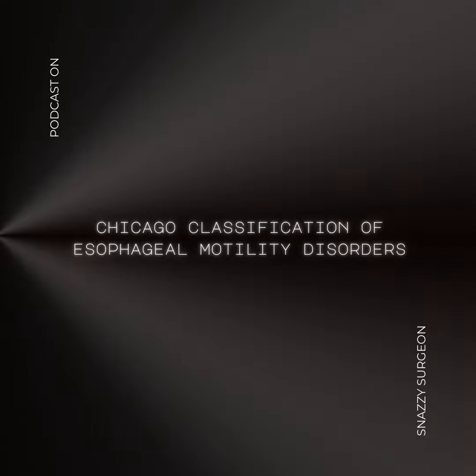And another thing, and this is super important when we're thinking about surgery, the severity of the patient's symptoms doesn't always match up with what we see on the manometry. You can have a patient with a sky-high DCI who's managing pretty well, and then someone else with a less impressive DCI who's really struggling. We have to remember, we're treating the patient, not just the numbers. Absolutely. The manometry gives us the physiological data, the objective measurements, but we can't forget about the patient's experience, their story. Right. So the bottom line is, if we find a motility disorder on manometry, it really needs to be backed up by the patient's symptoms, what they're telling us, or by other tests to really be clinically significant.